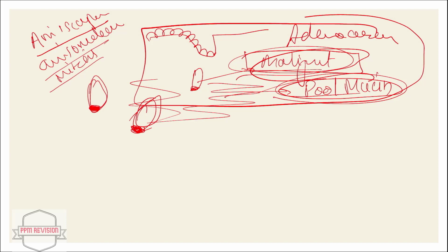Now moving ahead, we'll be looking at the metastatic carcinoma of the lymph node. The structure is simple. So firstly, we have the capsule. So the lymph node, yes, we have the capsule. Yes, this is nothing but the capsule. And then looking at the capsule, we also have the sinus that is here.